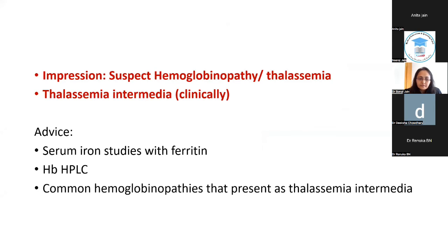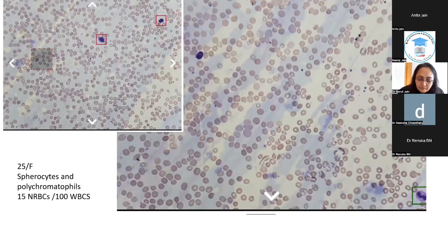So this is all in the smears, and this is the smear of microcytic hypochromic anemia. Now this is another patient, from standard routine practice, where we see all of this. You see these polychromatophils. Even if you don't have a retic count in your lab, this gray color stands out from the smear. Polychromatophils and spherocytes.